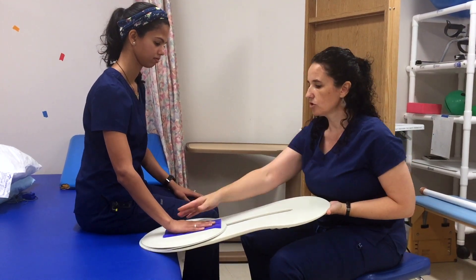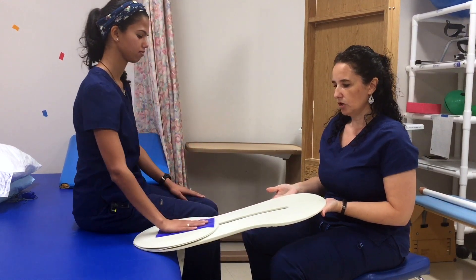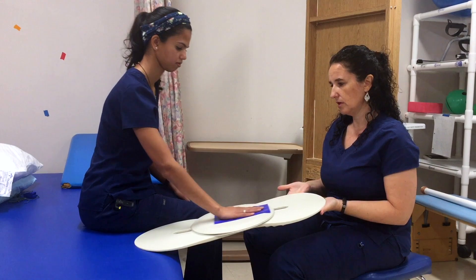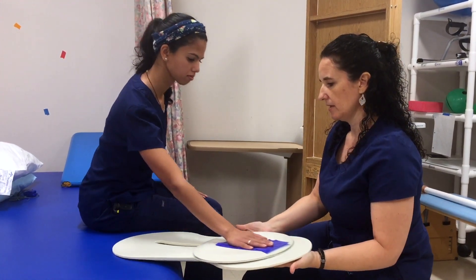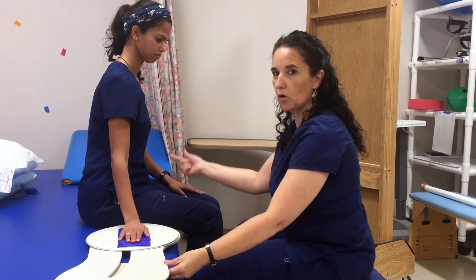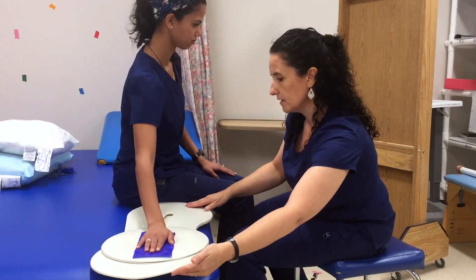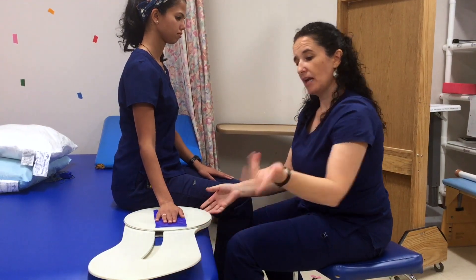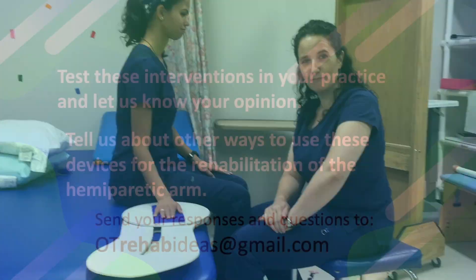I can hold it and have the patient come forward and back. You can have this supported on the table or you can just hold it yourself. Again, you can move it in different directions. You can even have it pressed on the mat and just work on that lateral weight shifting and weight bearing. Those are some interesting ideas that maybe you can try with your patients.